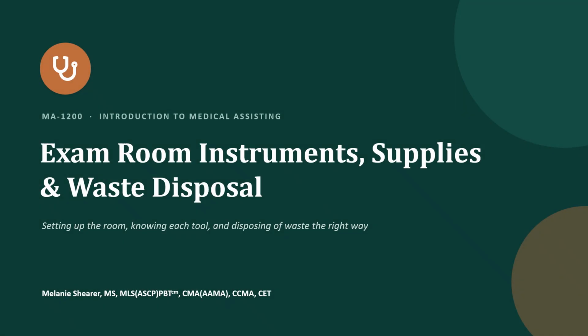Welcome, everyone. Today we're walking through three things you will touch in almost every clinical day: the instruments a provider uses during a general physical exam, the supplies you stock and hand off, and how we throw things away safely. These may sound like three separate topics, but they live together in the exam room, and they are all part of your job as a medical assistant.